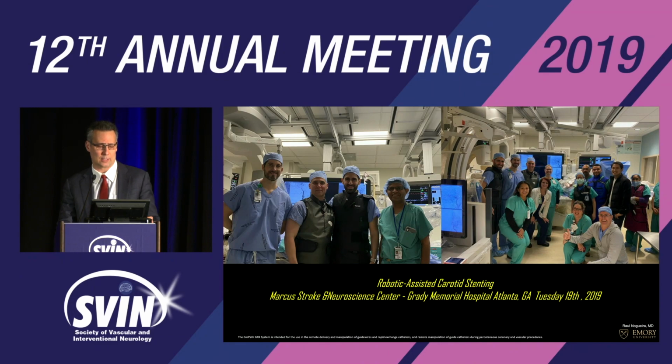And I just want to acknowledge everybody who helped with the procedure. But this is a new technology, okay? I think you're going to have baby steps. Absolutely, you can do everything that the robot is doing manually, right? But there is no radiation, great ergonomics, there is no lead. In this case, I was wearing lead. It's my first case because I want to be involved with both steps. But you don't wear lead, there is no radiation. And the precision is incredible, really.